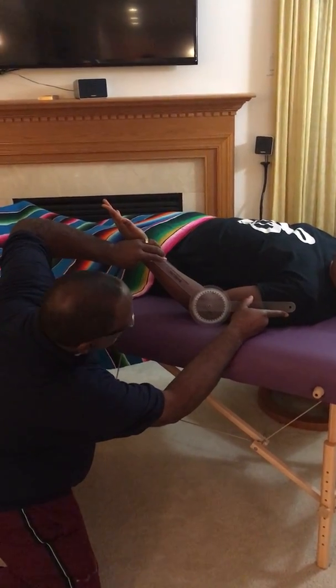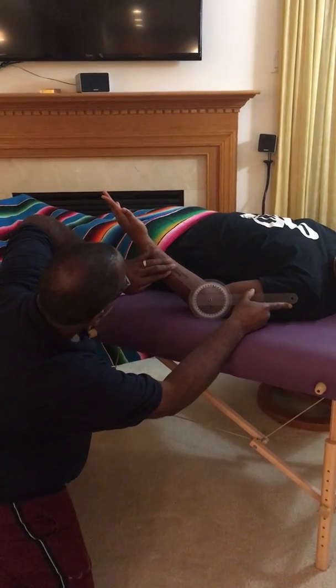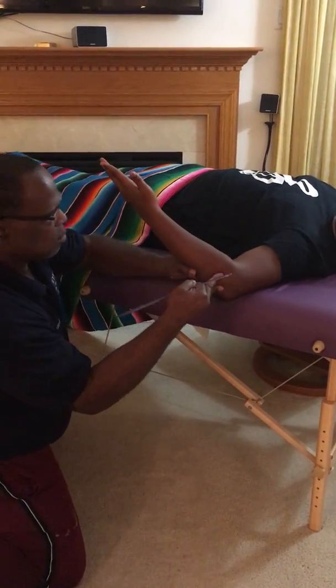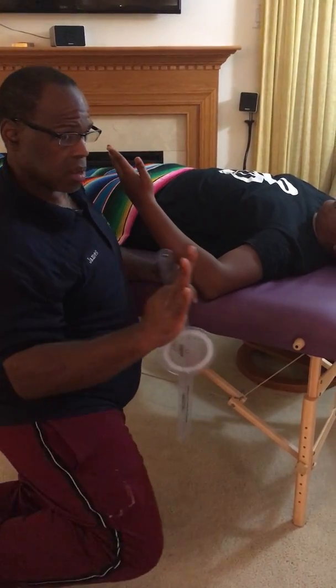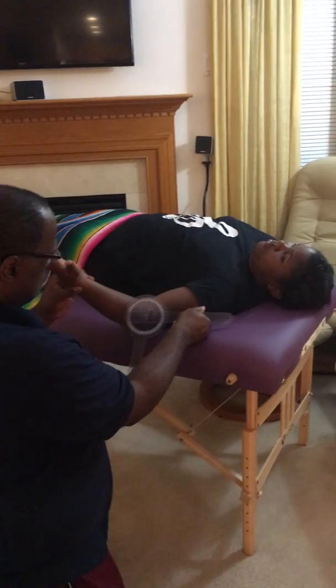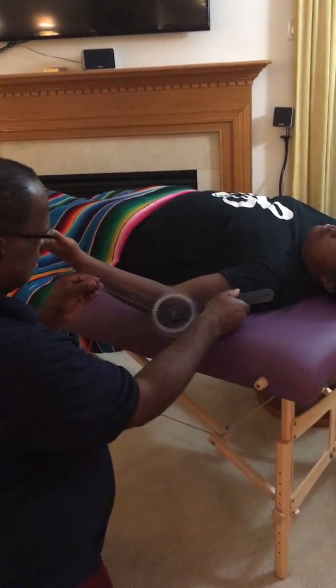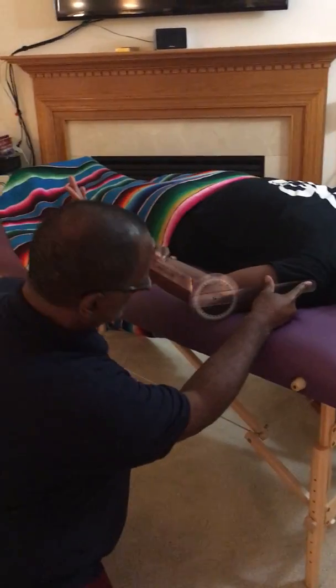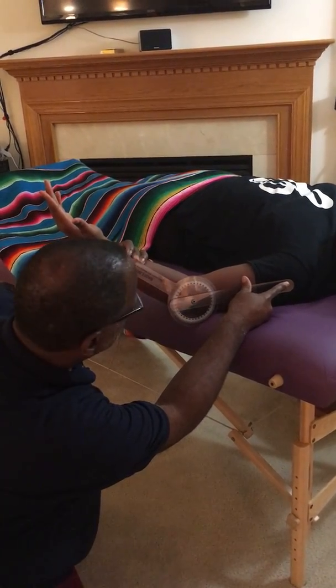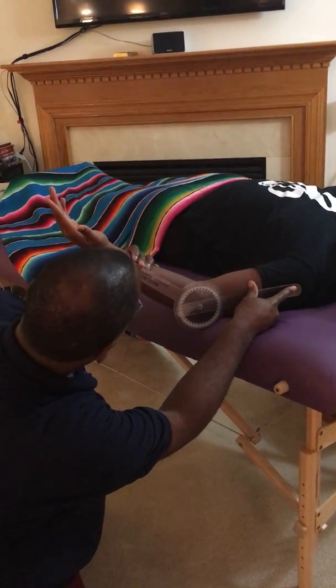And this, for her elbow extension. Matter of fact, let's bring your arm over here. Okay. Right there, good. And we're going to say that her elbow extension, or we'll say flexion first.